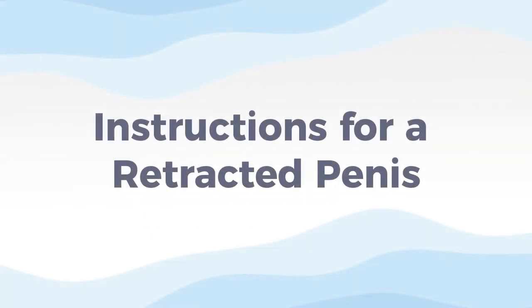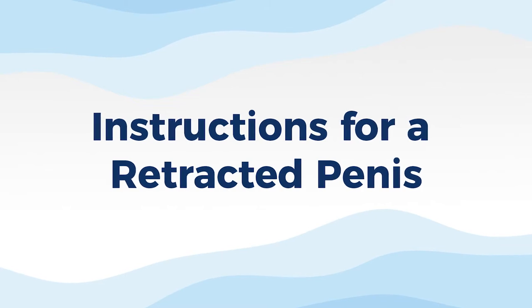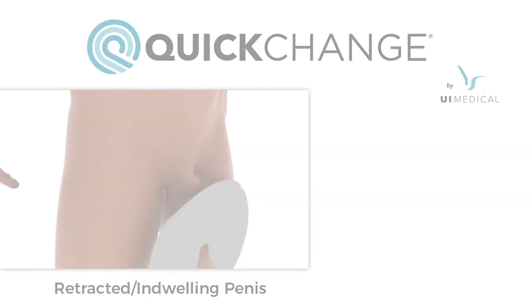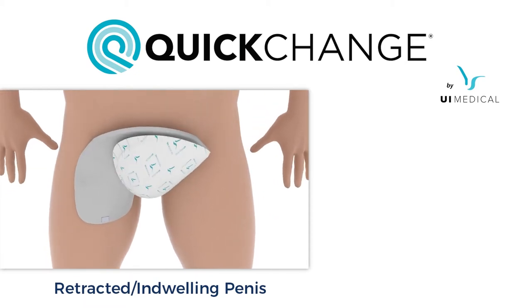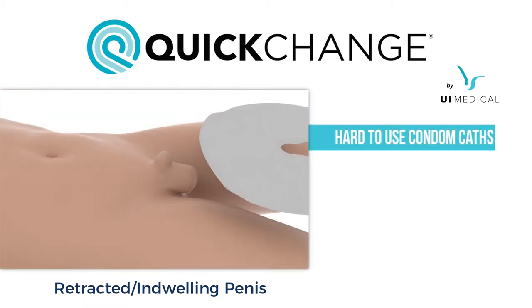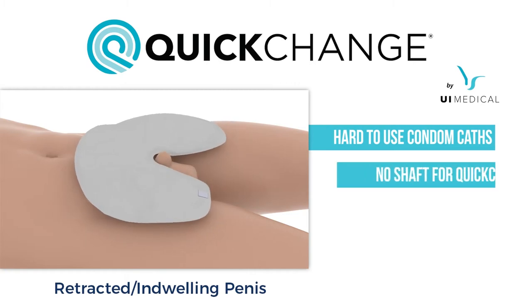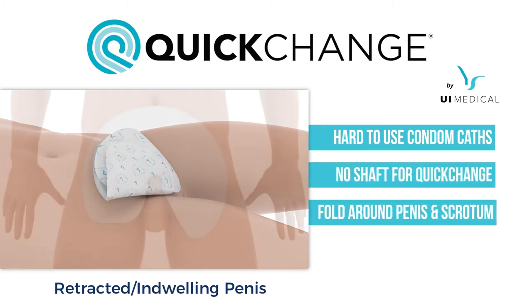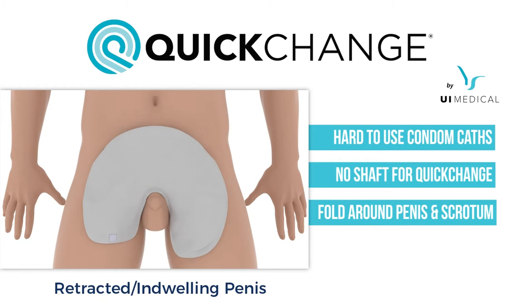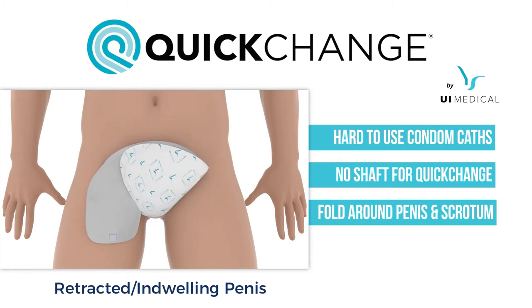The following instructions are for a retracted or indwelling penis. Some users and patients have retracted or indwelling penises, making it difficult to attach condom catheters or even quick-change wraps on the penis. In this circumstance, you will fold the wrap both underneath and around the scrotum as well as the penis.